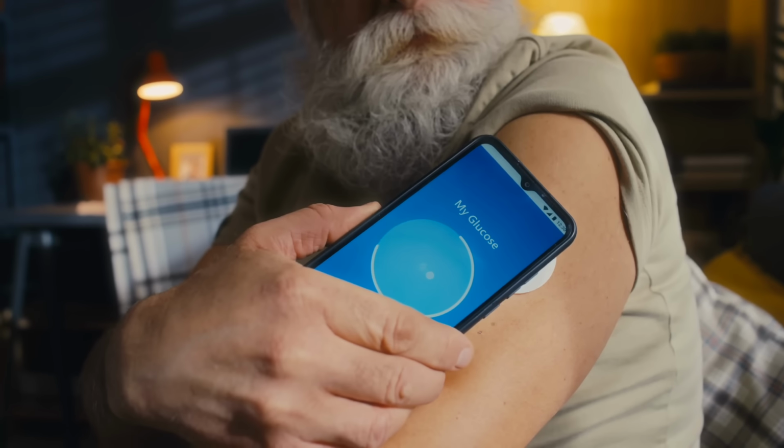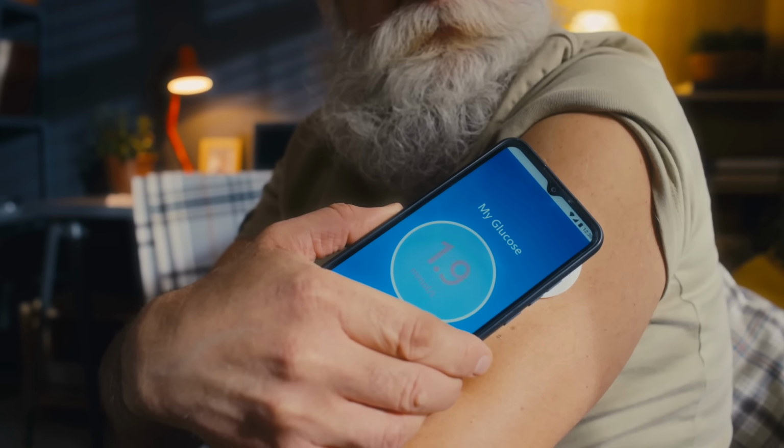In this video, I will help you interpret your CGM data by discussing what the scientific evidence tells us about normal versus abnormal glucose responses after a meal. CGMs can be an amazing tool, particularly if we use them not just to lower our acute blood sugar responses. That's a pretty easy thing. We just have to eat fewer carbs. No, where CGMs really offer an opportunity that I feel most people are not taking advantage of is to really understand our own glucose tolerance. That is the ability of our body to keep blood sugar in the normal range, no matter what we eat.